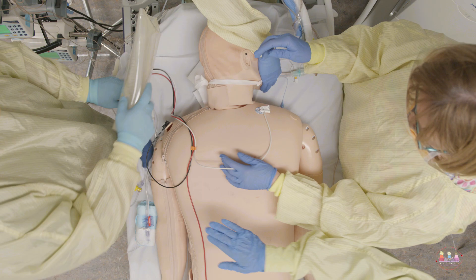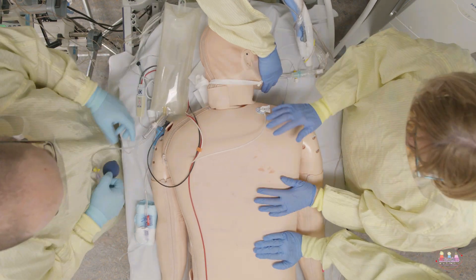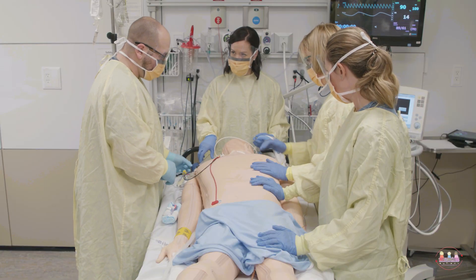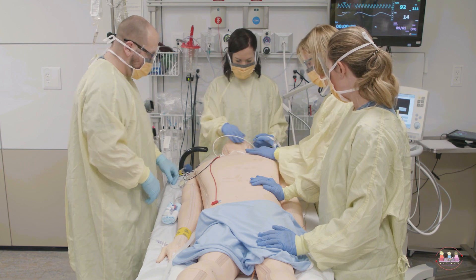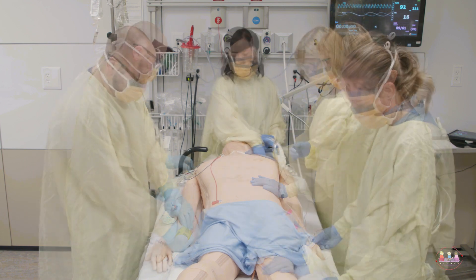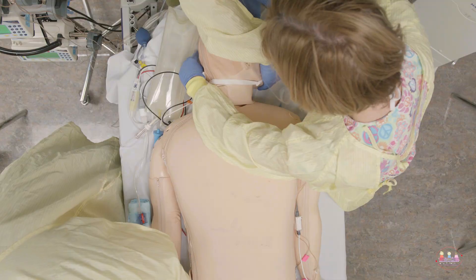Immediately prior to turning the child, the team should clearly discuss the roles, with the bedside RN directing the turn and the team member at the head of the bed ensuring the safety of the endotracheal tube throughout the turn.